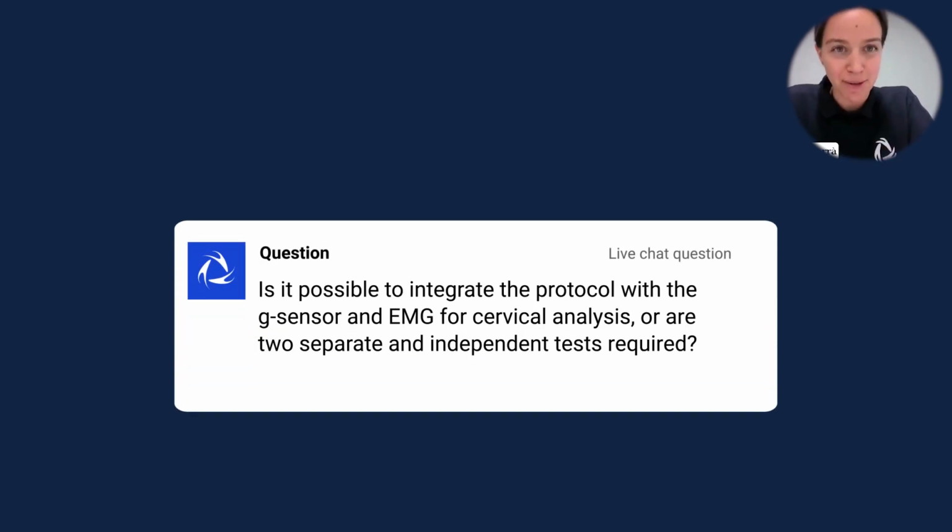Thank you. Another question, which I already answered in the box, was whether this protocol was specifically for kinematic analysis, so just with the infrared cameras, or can be upgraded to add EMG. Yes, also with the possibility to have the muscle activity during the same movement, during the same protocol. Our system is nice because you can upgrade and choose the tools that you really want for your analysis and research questions, in order to obtain the right data.